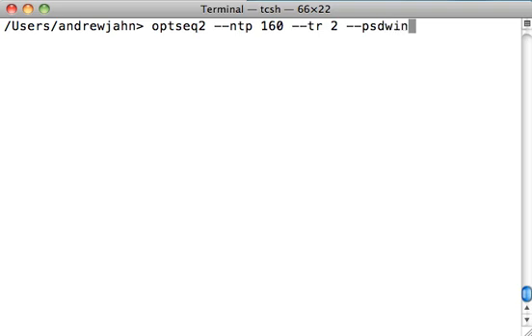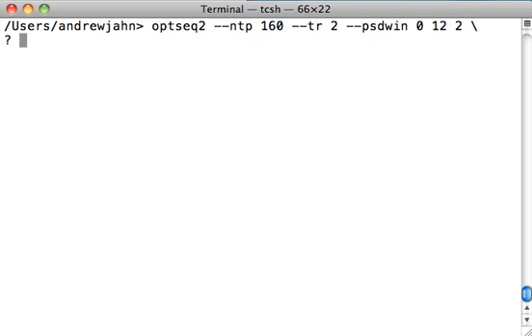Lastly, we're going to put in the PSD window. PSD stands for Post Stimulus Display, and it wants a minimum and a maximum. For example, what is the minimum amount of time that you would like in seconds after the presentation of each condition? In this example, let's say that there can be one condition following another without any interstimulus interval, no time between presentation of conditions. And the maximum that I want is 12 seconds between conditions. And the last argument, the third number you'll type in, is the TR explicitly. Notice this slash here means I want to continue on the next line without wrapping around from the edge.